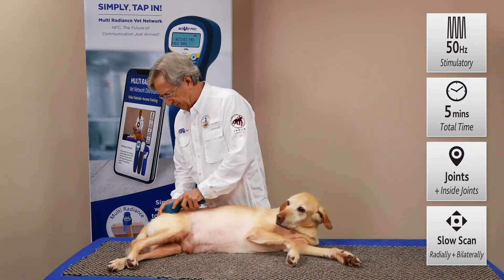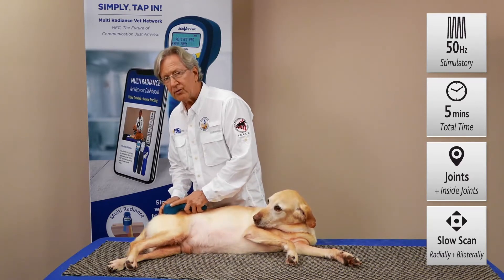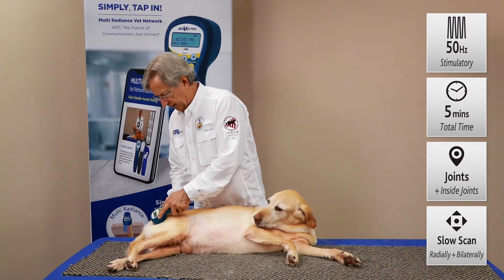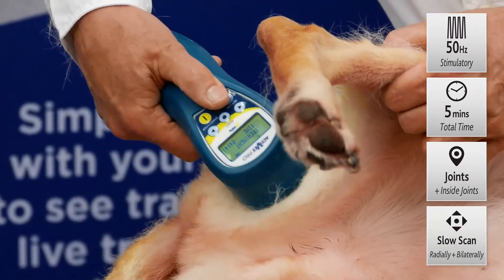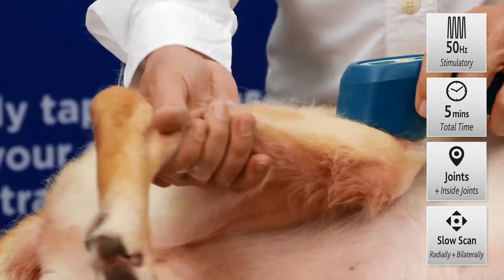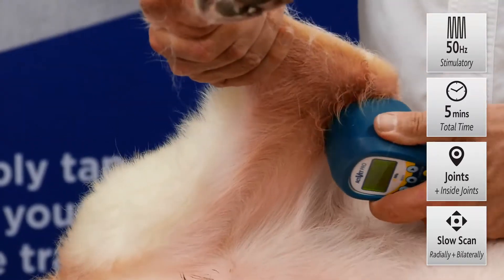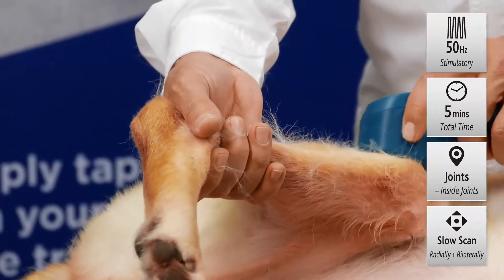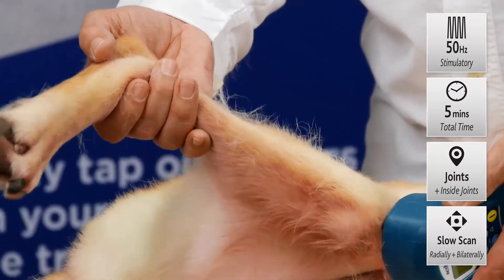We can start back here in the hips and work right around those hips, apply some firm pressure, but don't go too fast. Just nice and slow at a centimeter per second all around that hip, and then you can gently flex it to get inside where that inflammation lives. Come down to the next joint and treat radially, opening up that joint to allow the light energy inside where the inflammation is. You're getting that combination of 660 nanometers, 875 broadband infrared, and your 905 super pulse laser.